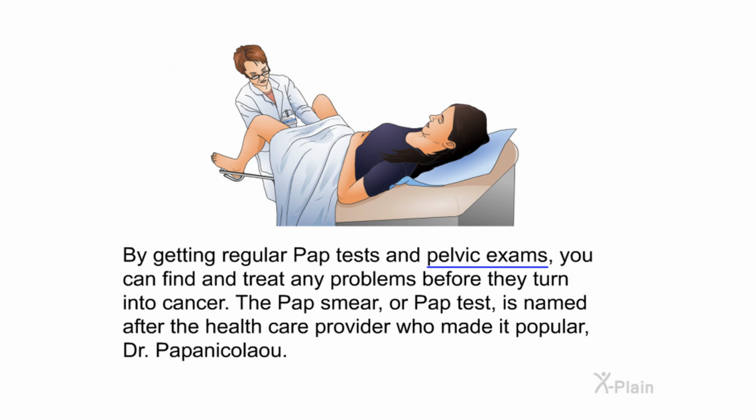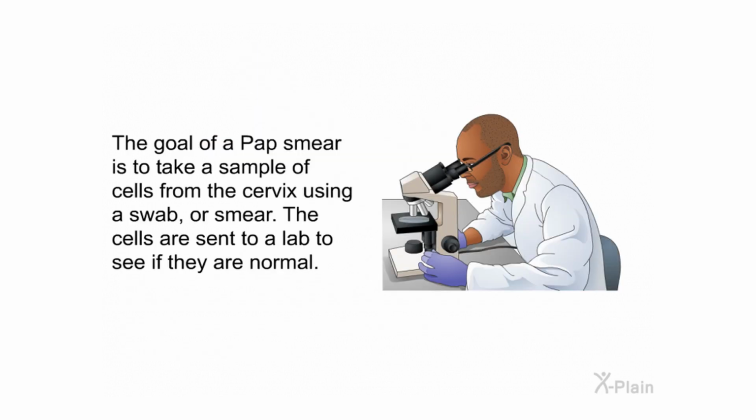The Pap Smear, or Pap test, is named after the healthcare provider who made it popular, Dr. Papanicolaou. The goal of a pap smear is to take a sample of cells from the cervix using a swab or smear. The cells are sent to a lab to see if they are normal.